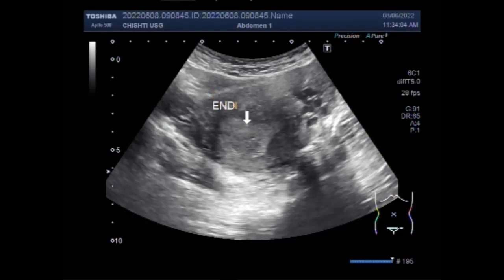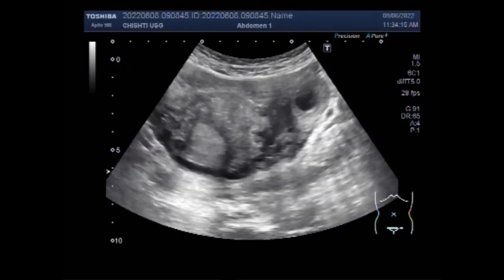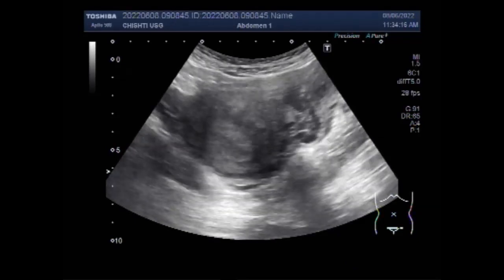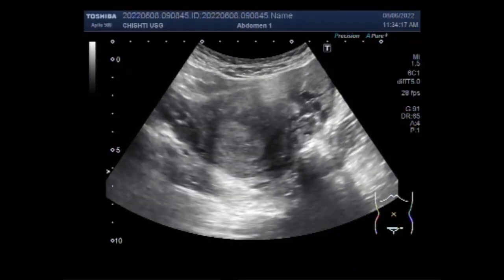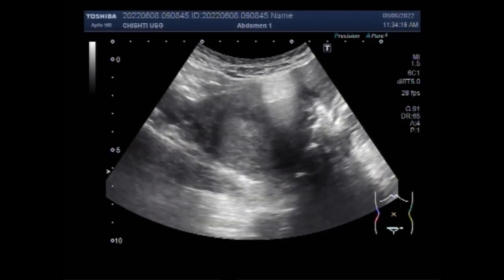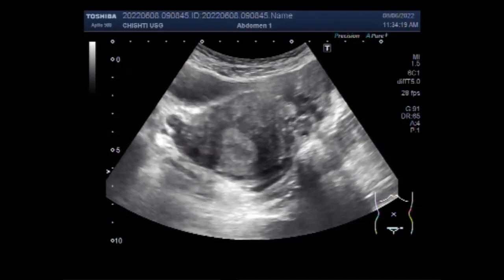You can see the endometrium of this patient is thickened. We can measure the endometrial thickness, and it is increased, as you will see further in this video.